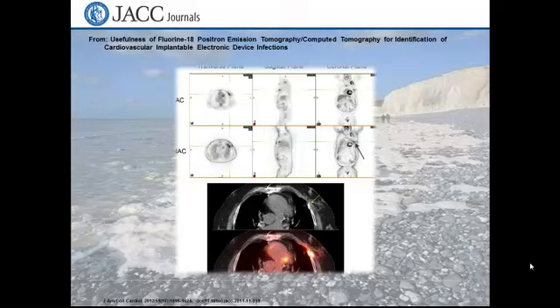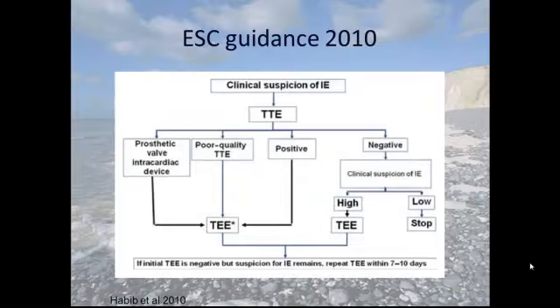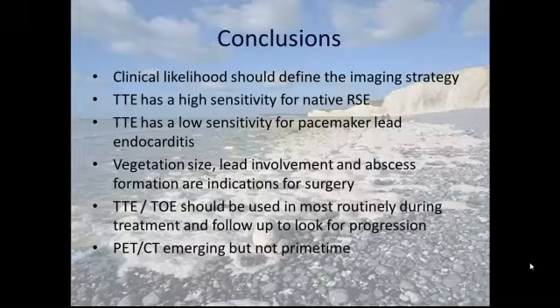But it is worth taking a health check here. This is done in highly specialized centers, and not only that, if you look at the literature more generally, it's extremely good at the box, but whether it's quite as sensitive at the lead as it's been billed in the past is difficult to say. I'm going to gloss over that because Thomas used the same penultimate slide as me. We'd obviously coordinated well there, and move on to some conclusions.